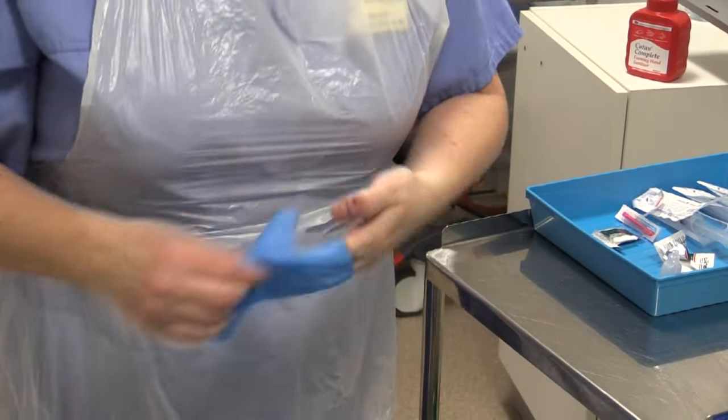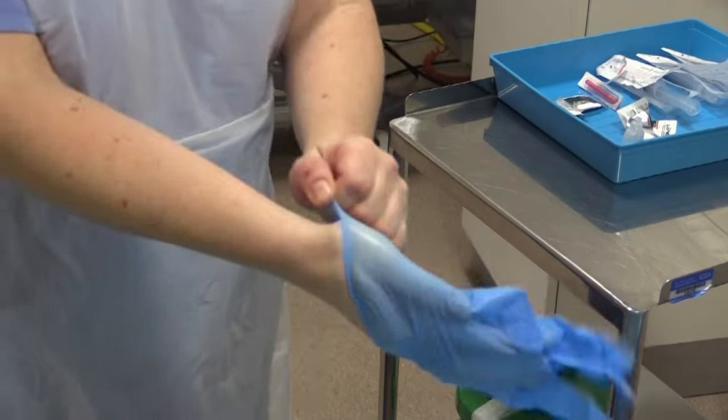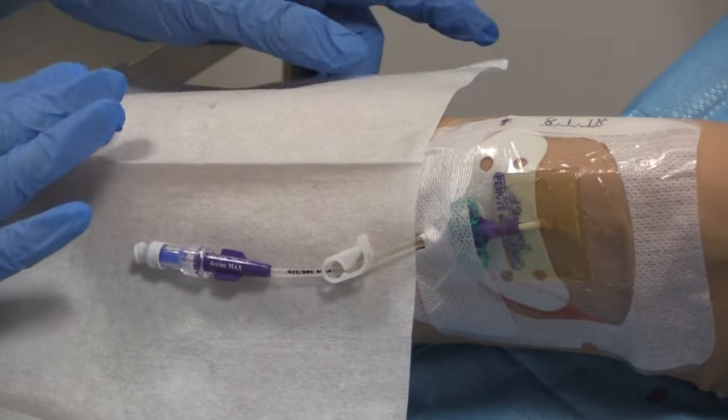Remove your gloves, discard, gel your hands, and put on new gloves. Place the clinical laminate sheet between the line and the patient's arm.